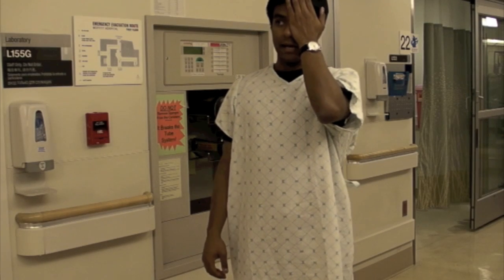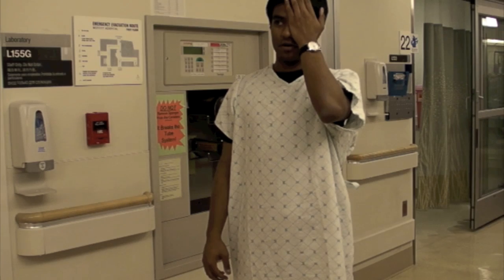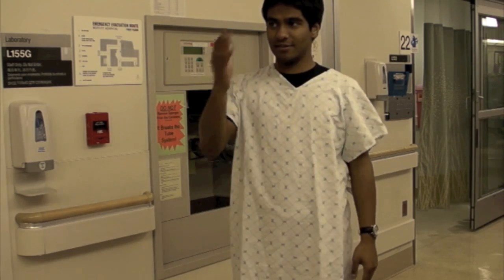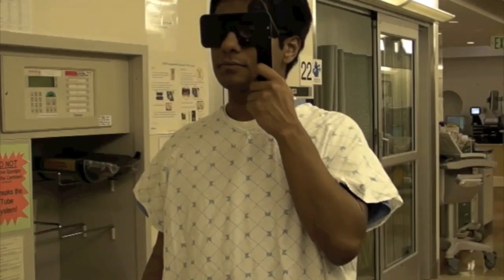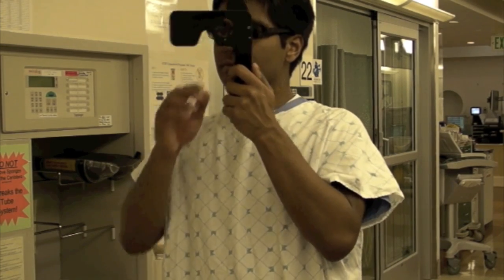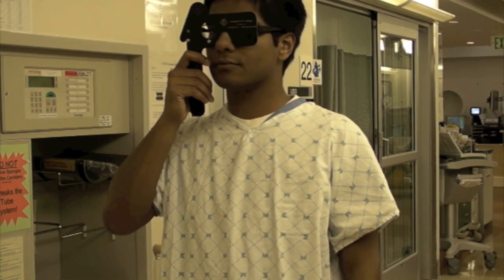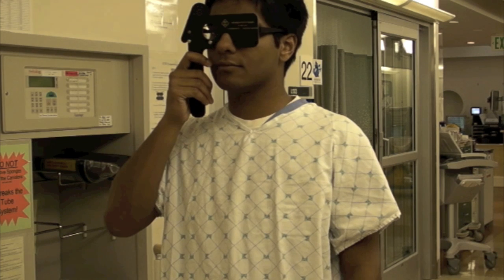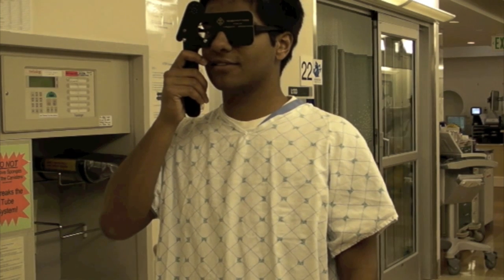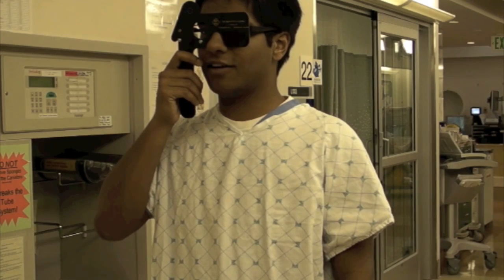Test one eye at a time to get a visual acuity reading for each eye by having the patient fully cover an eye with their palm. Alternatively, you may use a handheld eye occluder, such as the pinhole mask with pinholes lifted up. If the patient uses corrective glasses or contact lenses, the patient should use them so that they can give you their best visual acuity.